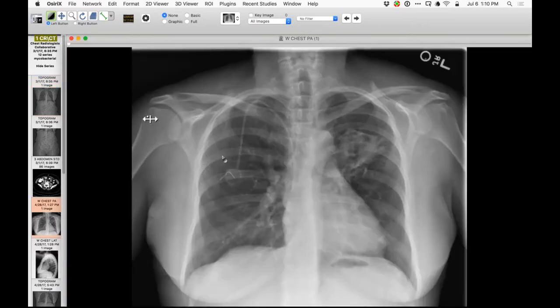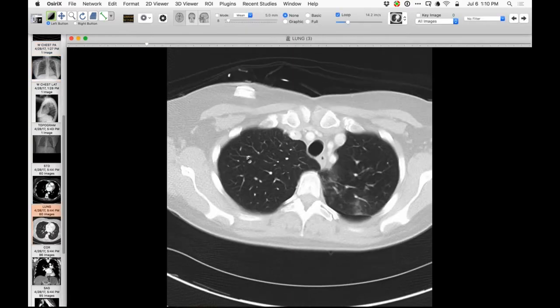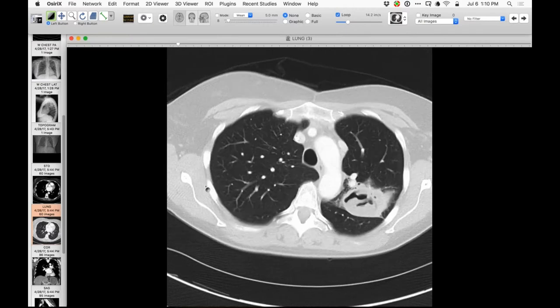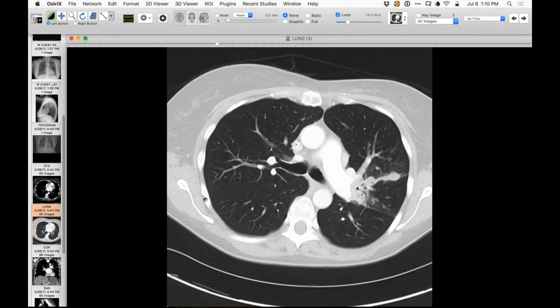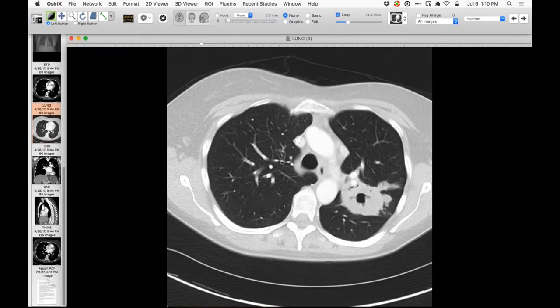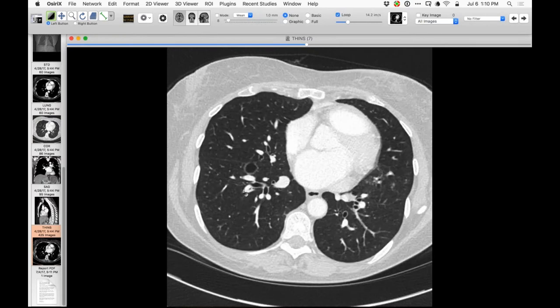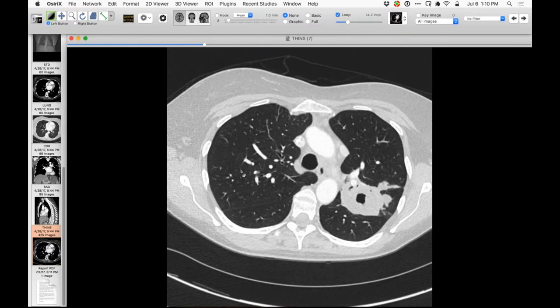The next month you can see the lesion here - the patient has a catheter in for treatment of breast cancer. It's quite large in the left upper lobe, and you can see there is cavitation within. Here is the CT that goes along with that showing the extent of cavitation within this opacity in the left upper lobe. The person reading this really just gave a differential that referred to metastatic disease.